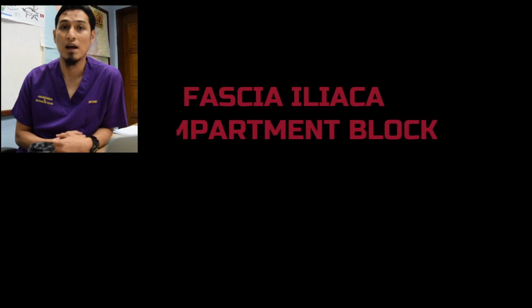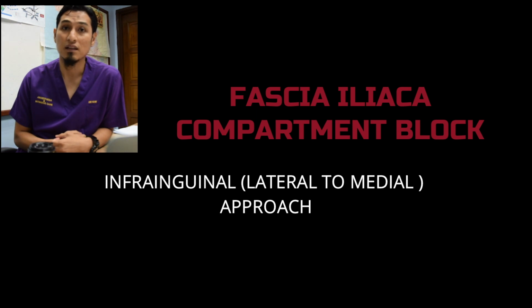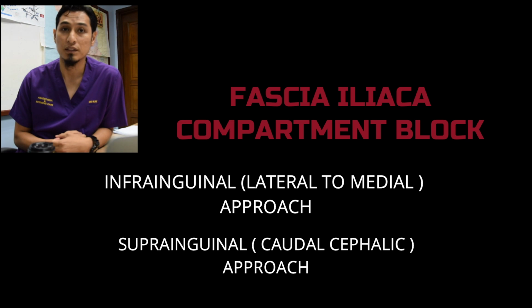In this video, we will show you how to perform fascia iliaca compartment block as an analgesic modality for hip trauma. There are two approaches for this block. The first one is infra-inguinal, lateral to medial approach, and the second one is supra-inguinal, caudo-cephalad approach. In this video, we will show you supra-inguinal approach with direct longitudinal axis technique.